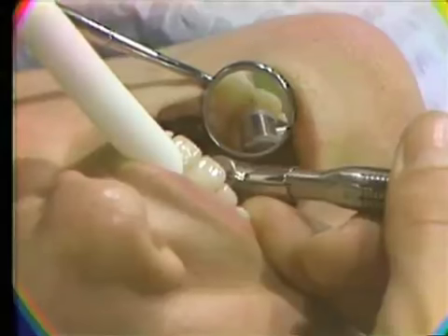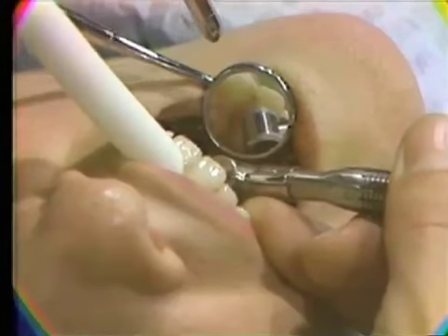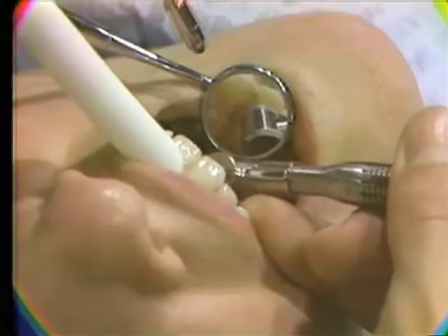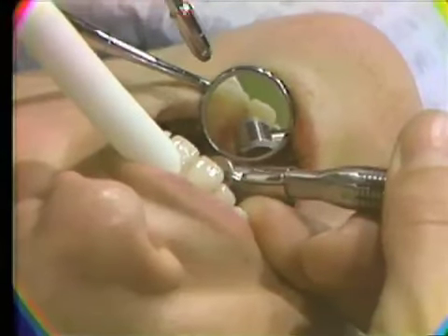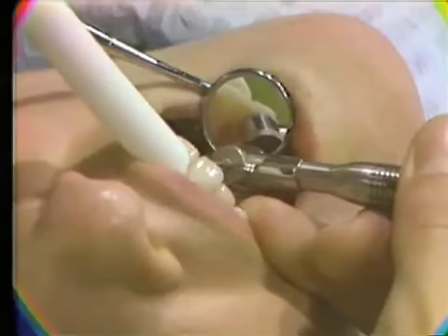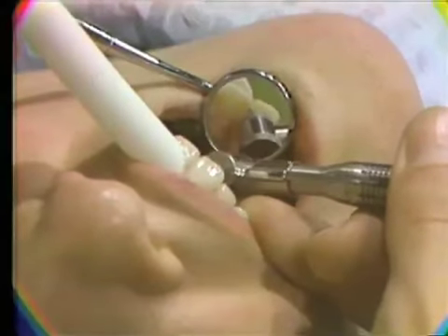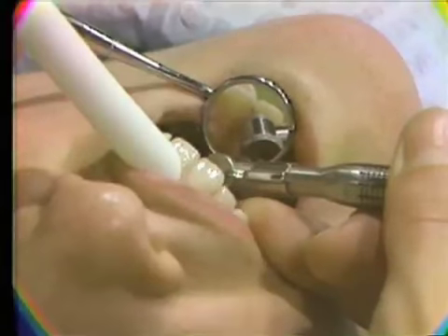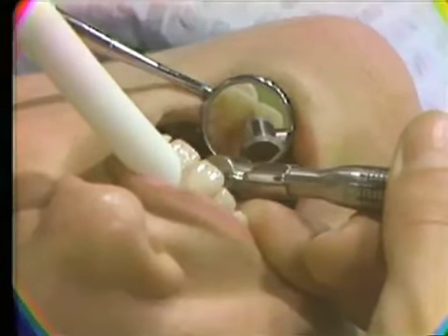The oral evacuator is used as a retractor and to control the water spray from the handpiece. It is placed to the labial of the tooth being treated with the opening directed toward the head of the handpiece. Excellent access and visibility are possible in the maxillary anterior segment using these guidelines regardless of which approach is used.